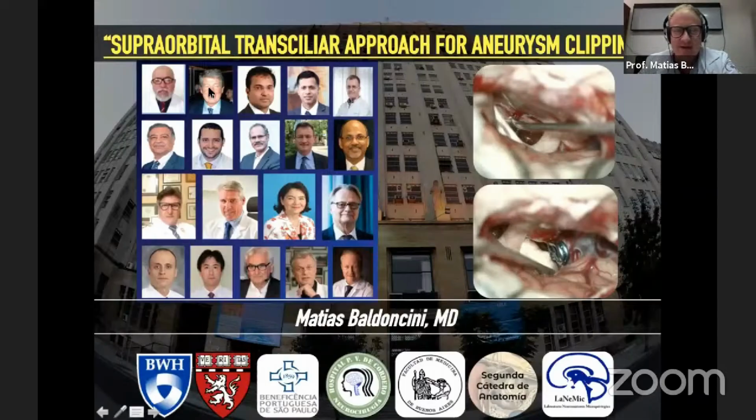This lecture is related to a special keyhole approach through the trans-eyebrow approach, performing a supraorbital transciliar for clipping aneurysms, especially for anterior circulation aneurysms.